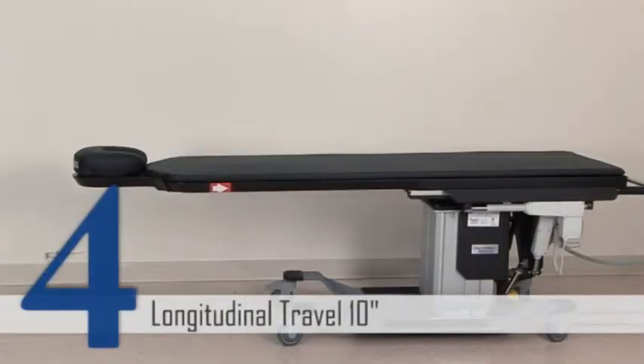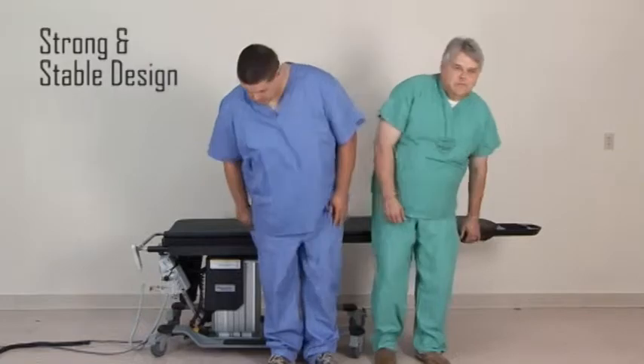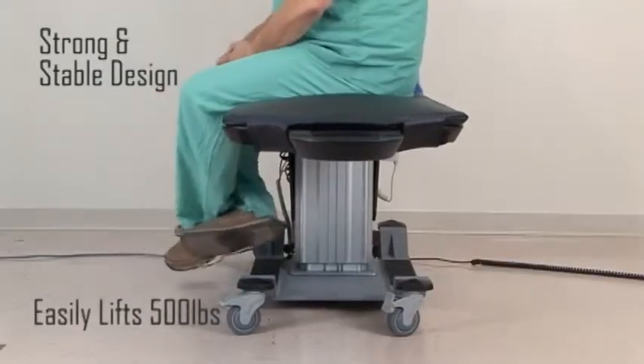A full 10 inches of longitudinal travel helps speed up positioning. The strong and stable design features an oversized lifting column that is incredibly rigid and capable of lifting over 500 pounds.